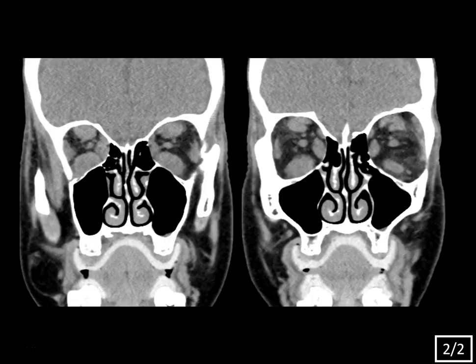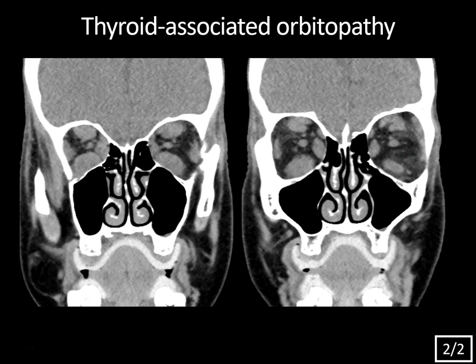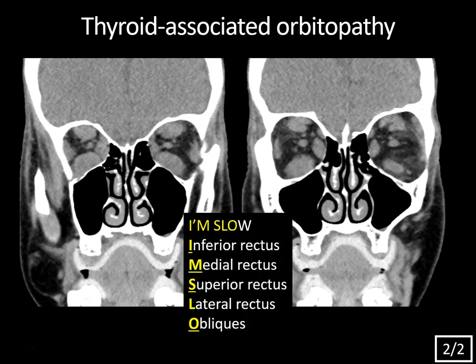This is much easier to see on the coronal images — marked thickening of the extraocular muscles and fat stranding within the orbital fat. This is typical for thyroid-associated orbitopathy, also known as Graves' ophthalmopathy. It's the most common cause of proptosis in adults and is typically associated with Graves' disease. On imaging you get bilateral symmetric enlargement of the extraocular muscle bellies with sparing of the tendinous insertion. The mnemonic is 'I'M SLOW': Inferior rectus first, then Medial, then Superior, then Lateral, then Obliques.